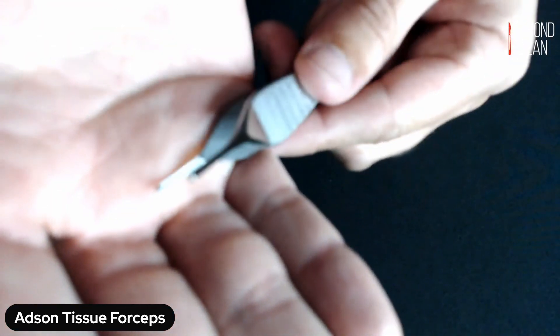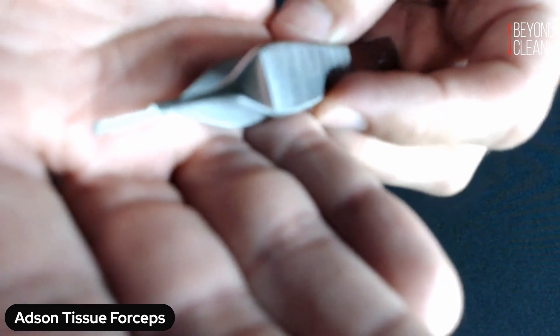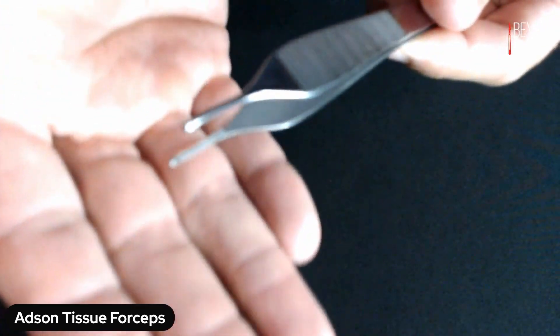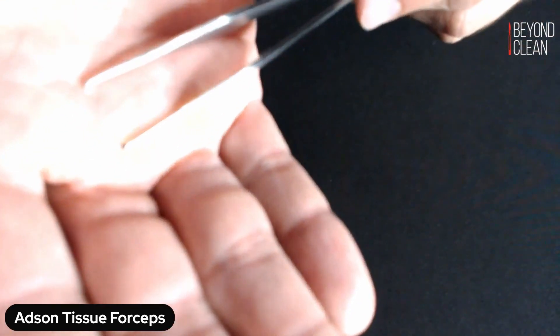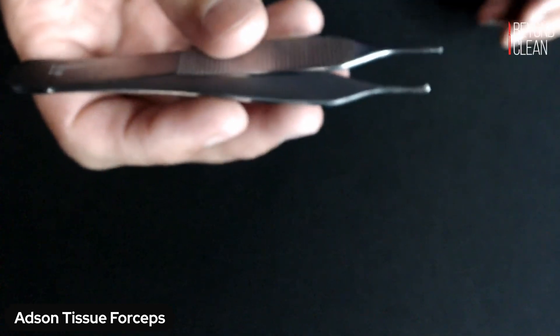And depending on your facility, sometimes they will just call them Adson tissue forceps. Sometimes you will have Adson with teeth and that's the tip off there. Again, this is a normal Adson with teeth, nothing too special about it.